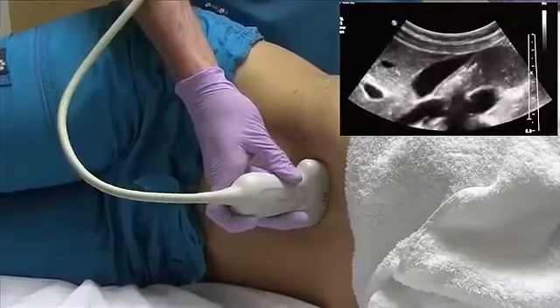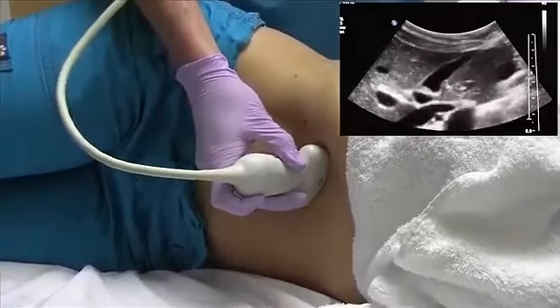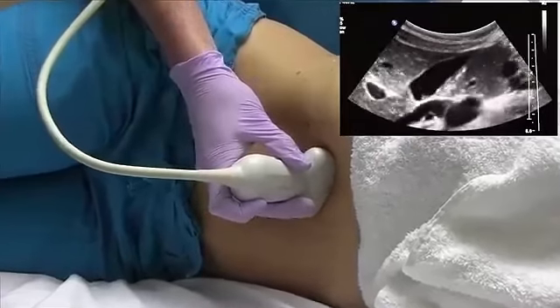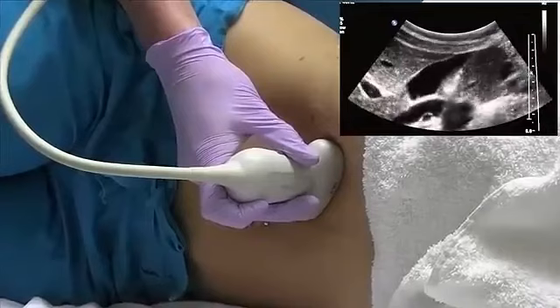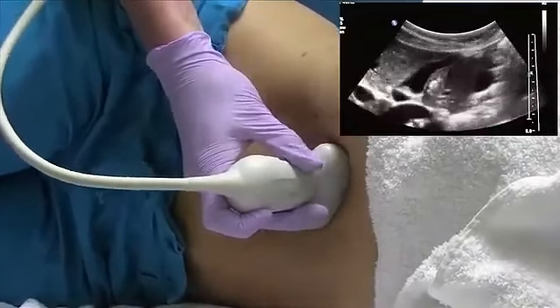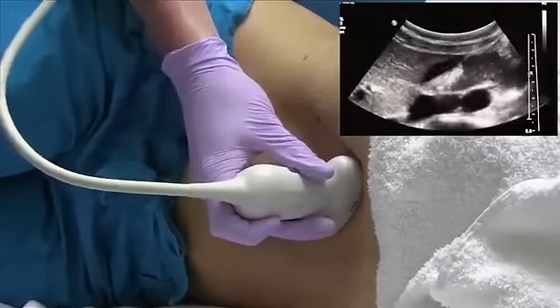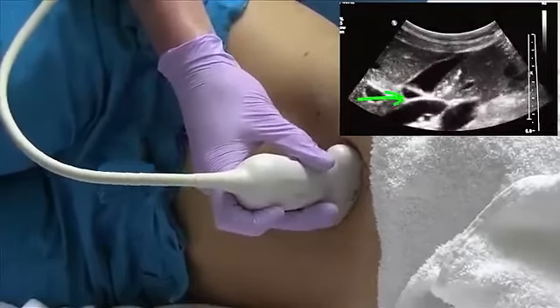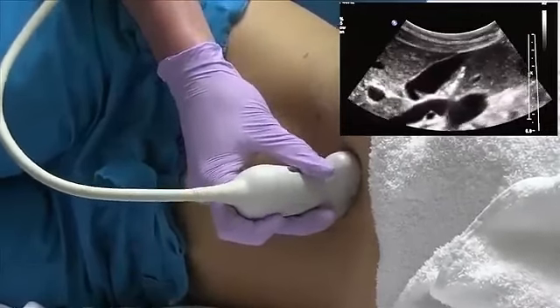I like to start in a sagittal plane from here. You just want to make sure you sweep through the gallbladder, and if there are any stones, they should drop into the fundus of the gallbladder from this plane. This is also good for opening up the neck of the gallbladder to make sure there are no stones impacted in the neck.